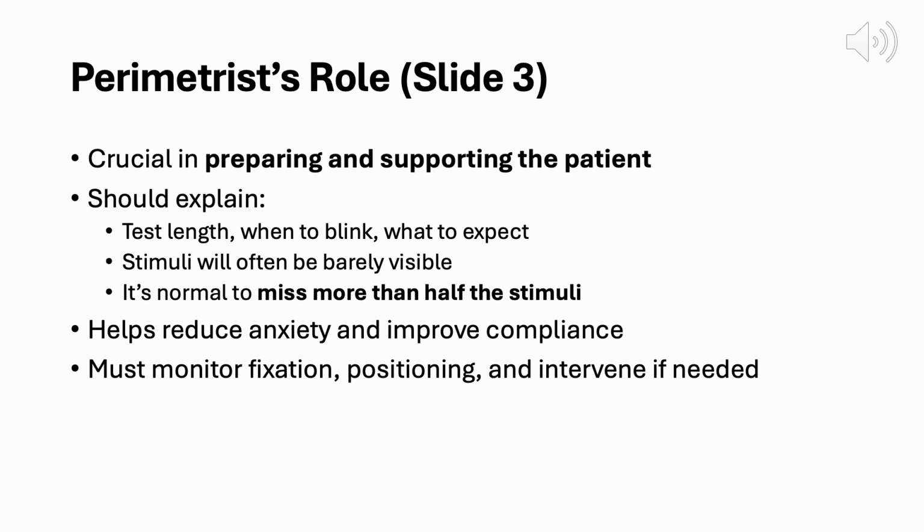During the test, the perimetrist should continuously monitor the patient's fixation and head positioning, making adjustments or offering encouragement if needed. Even minor lapses in attention or alignment can affect the outcome, so active support is essential throughout the exam.